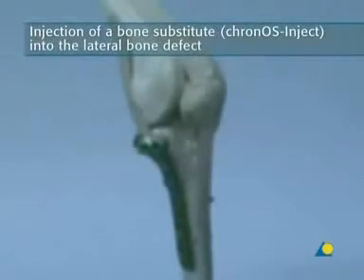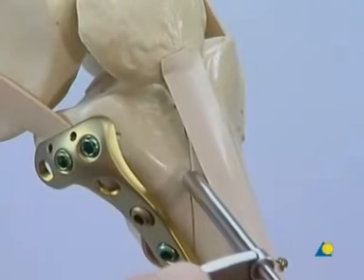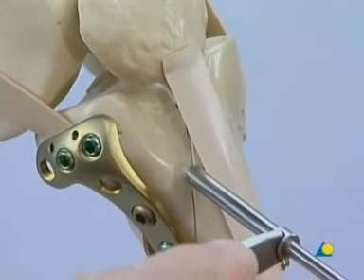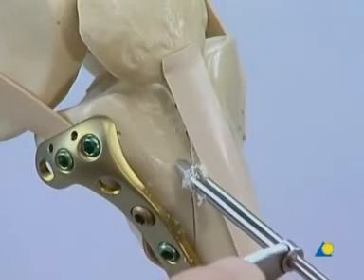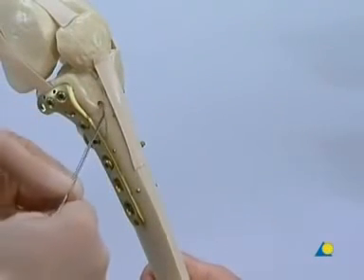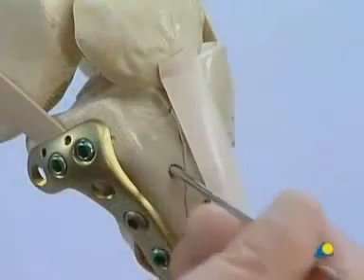Injection of a bone substitute, Chronos inject, into the lateral bone defect. A hole is drilled in the anterior cortex using a 4.5 mm drill. A probe is inserted into the bone defect and used to impact the bone debris to create a single space for the introduction of the Chronos inject.